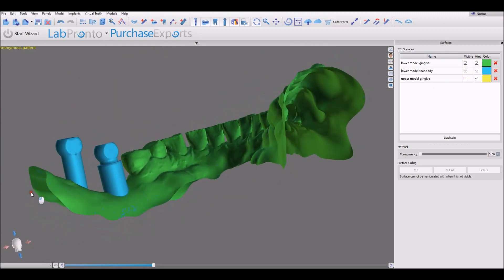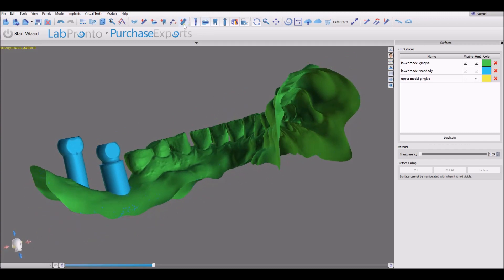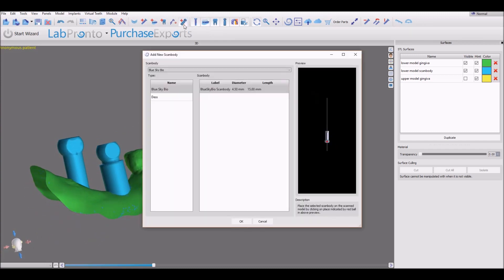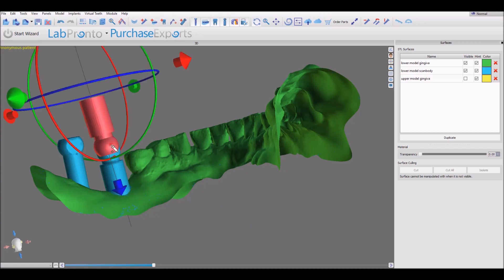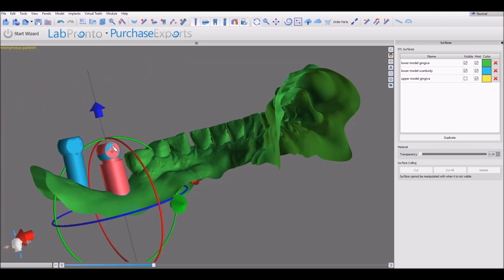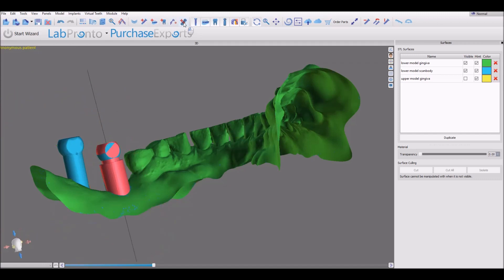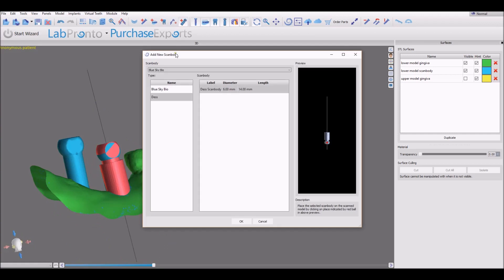The first thing we're going to do is align the scan body. We click the Add Scan Body button, select the relevant scan body from the drop-down list, and then left-click on the flat surface of the scan body. The software aligns and orients the scan body. Let's do that again for the second scan body.